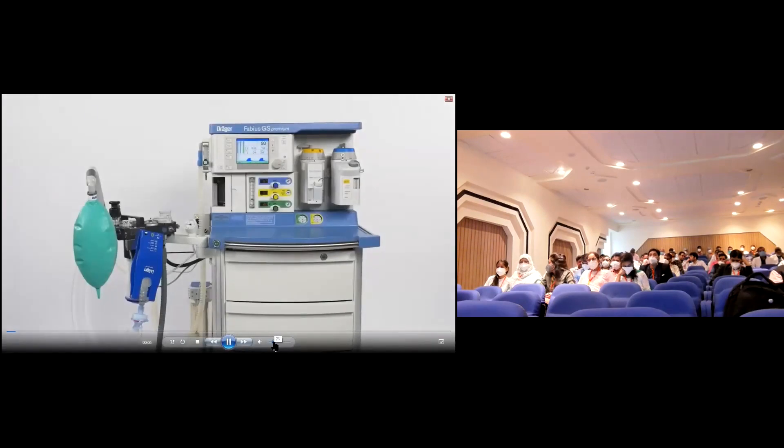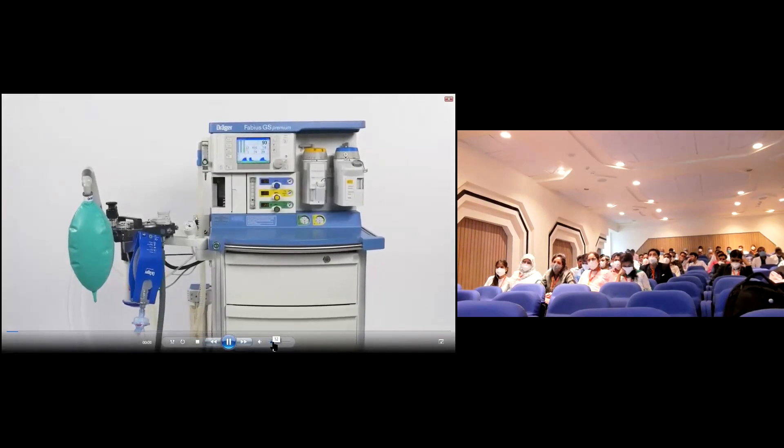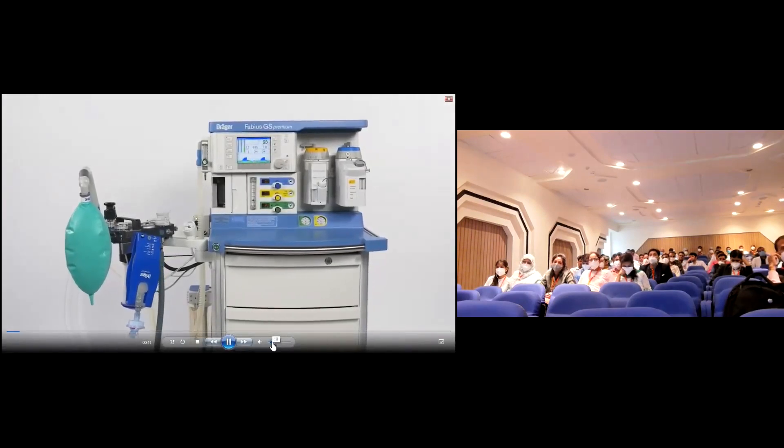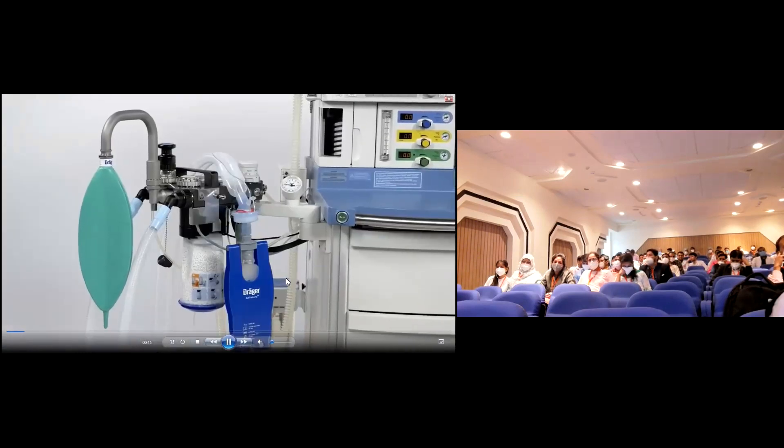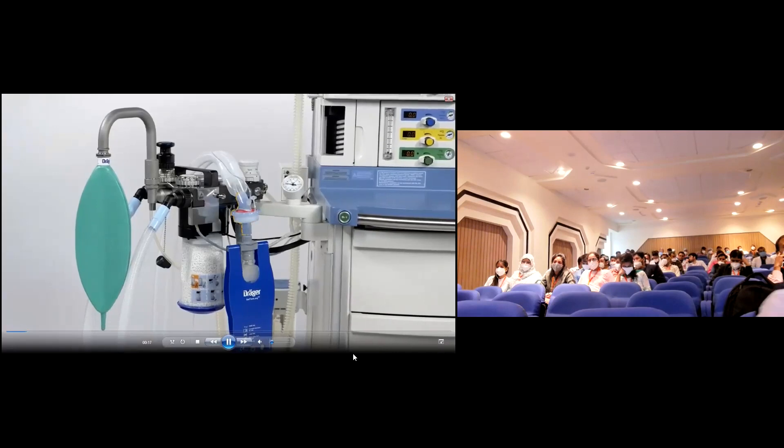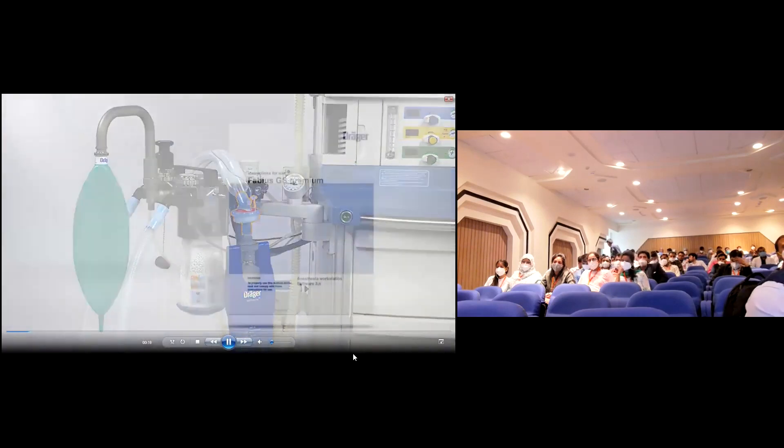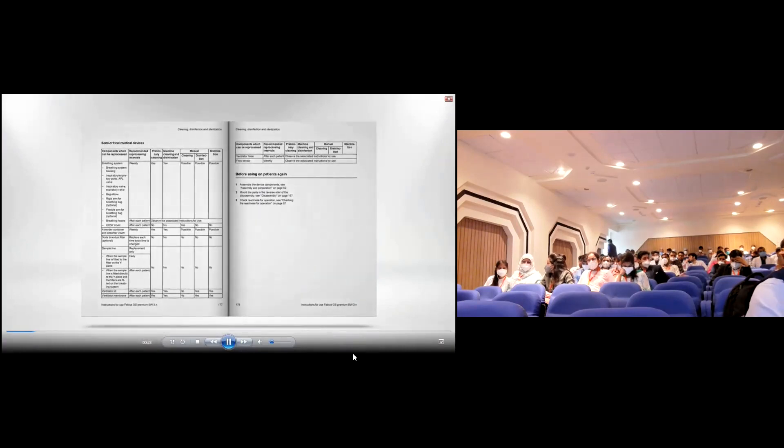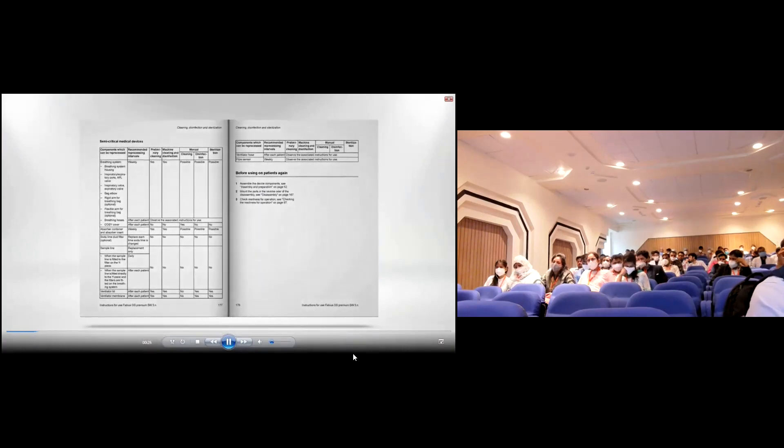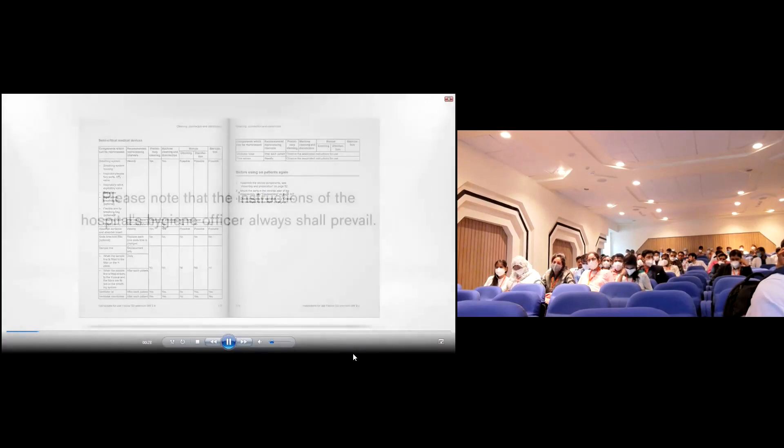In the following part, we would like to demonstrate how to reprocess components of the Fabius GS Premium which frequently need to be cleaned. Please note that any reprocessing intervals depend on the patients and on the use and position of filters. A table containing information on the frequency of cleaning depending on different filter setups can be found in the instructions for use of Fabius GS Premium.